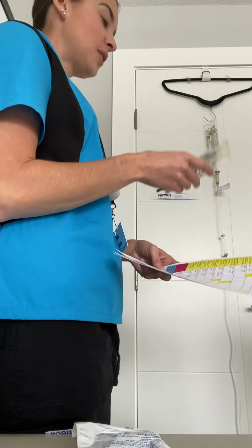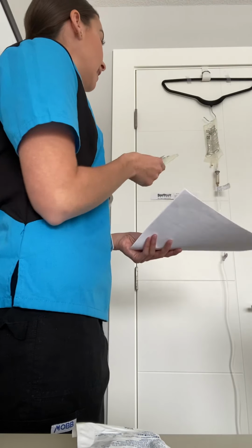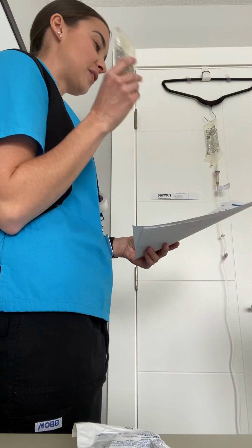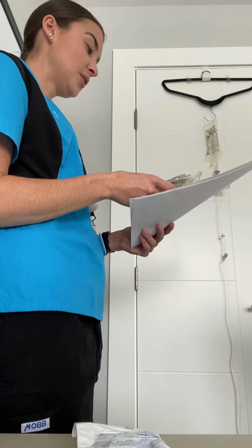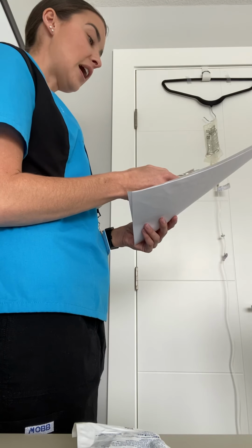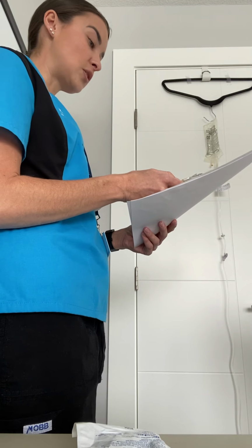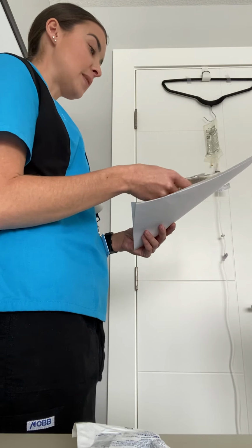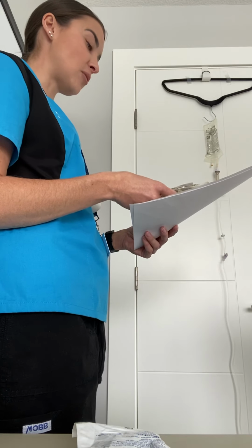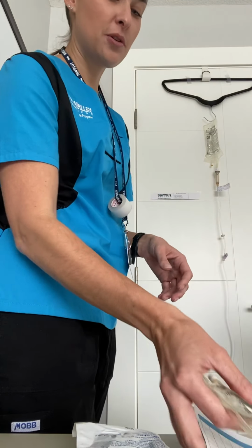So I do have the medication here, and I'm just going to do one last check before I go ahead and assemble it. So we have Allison Schnook, which is you. We have Allison Schnook here. We are to give dexamethasone, 4 milligrams, IV piggyback at 1500 on October 26, 2020. Okay, so it all matches up. And the reason, again, Allison, like I said, we're going to give it for your nausea and vomiting, okay? Perfect. Okay, so I'm just going to put those down.